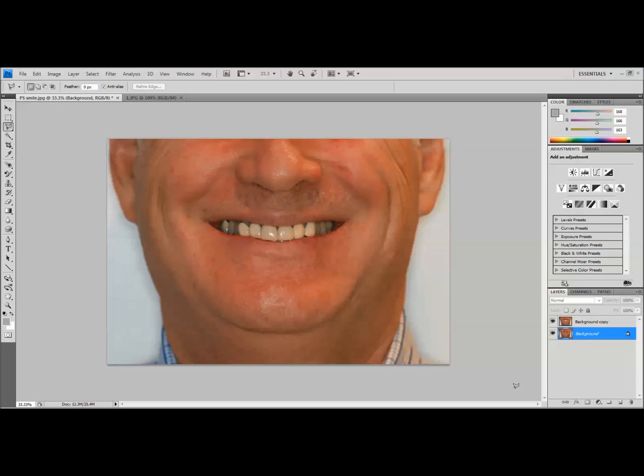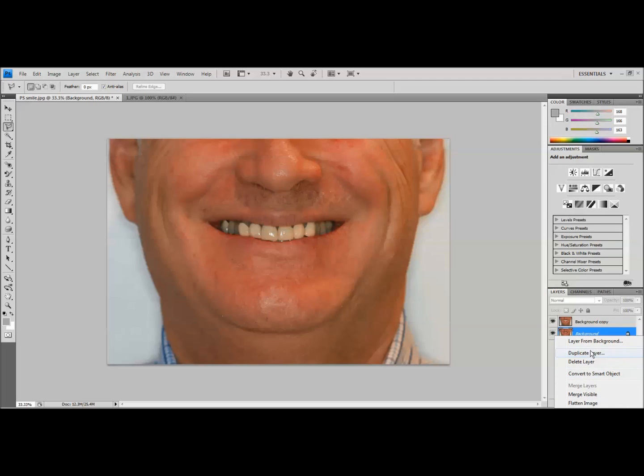Anytime we do anything in Photoshop as far as smile simulation, we're going to go ahead and duplicate the layer. As you can see down here on the bottom right, if you just go in and click on the picture, you can say duplicate layer and you can always have a backup. You always want to have that backup there so that if things go haywire, you don't like a change that you've done, you've always got something to get back to where you started from.